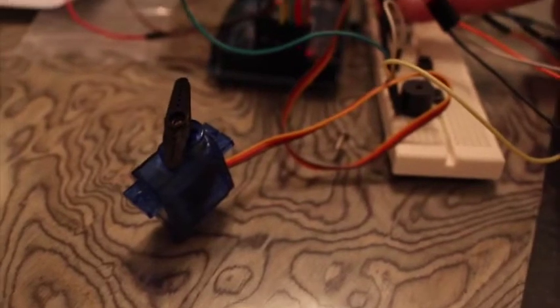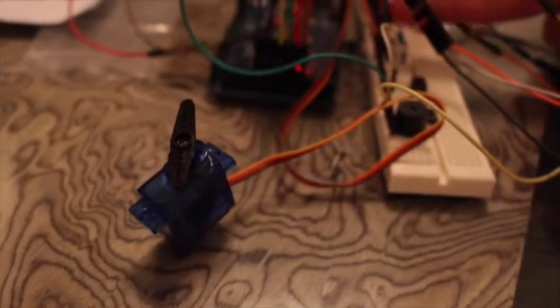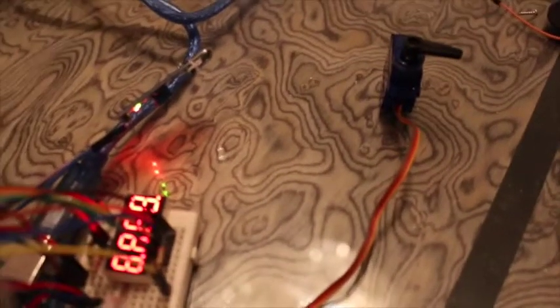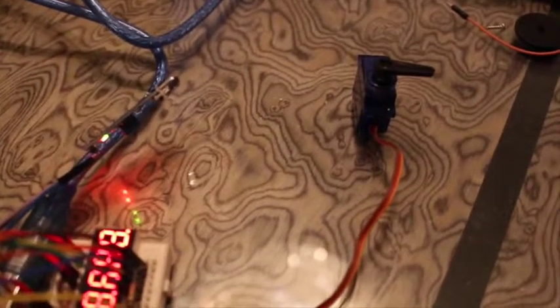This is the servo motor that's responsible for dispensing the medicines from the box. And this is the servo motor that's responsible mainly to listen to the IR sensor, and when it detects the patient's hand, it dispenses the medications into his hand.